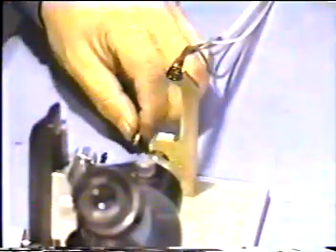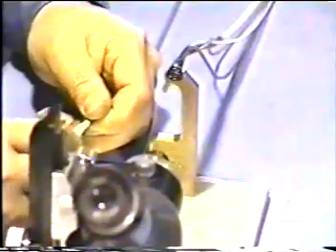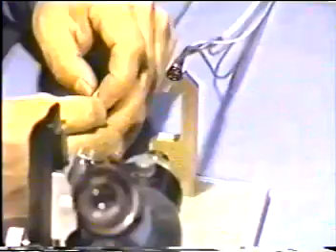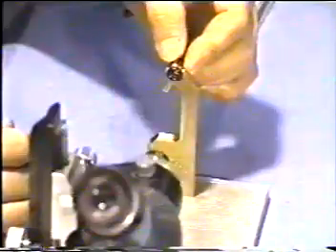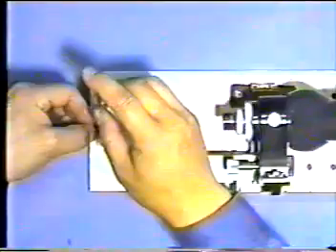Clean the end surface of the IG with lens paper. Clean the objective lens assembly as well. Insert IG into the barrel assembly DEL and attach it to DTA. Fasten IG tentatively.